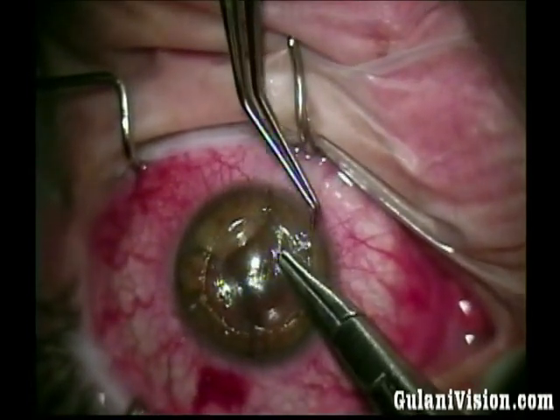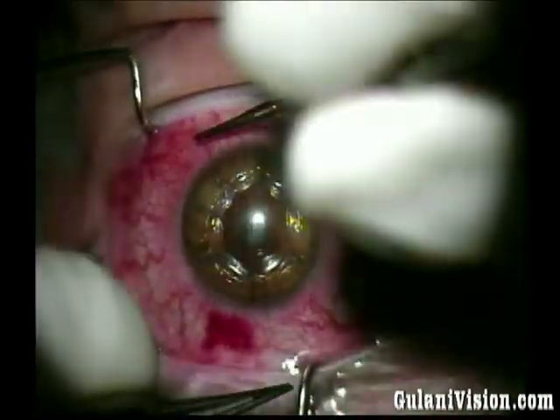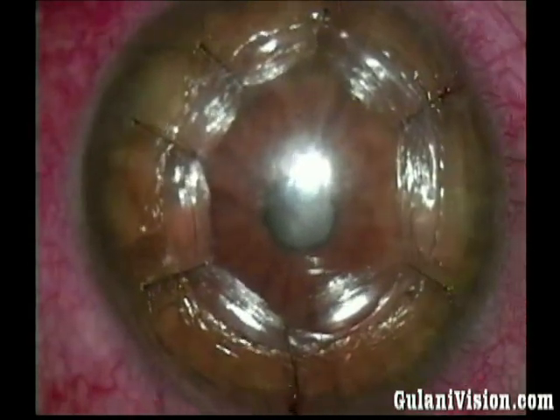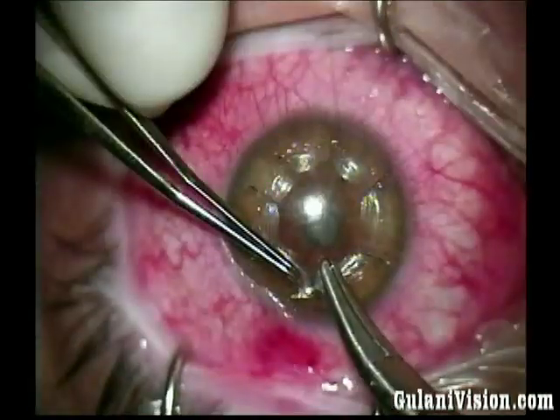So these sutures are mostly to compress the graft to decrease the ectasia, decrease the keratometry, and secure the graft in this very unstable cornea. And I'm not giving up my desire to still do my anti-torque, which gives me the resultant endpoint. And here we are finished with our interrupted sutures.